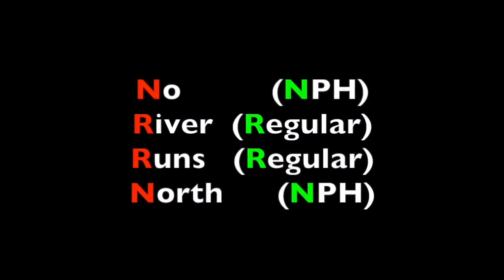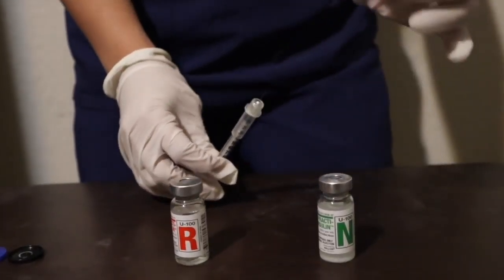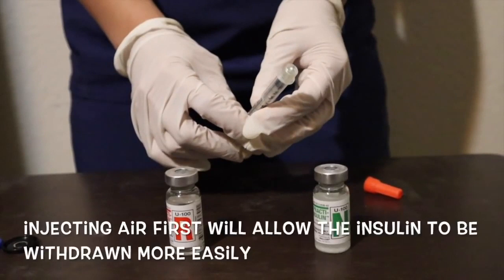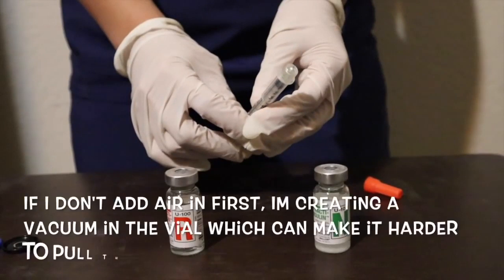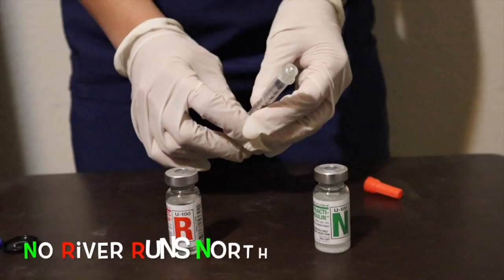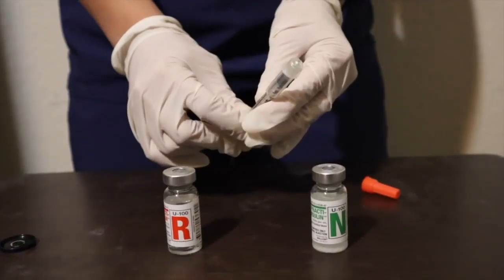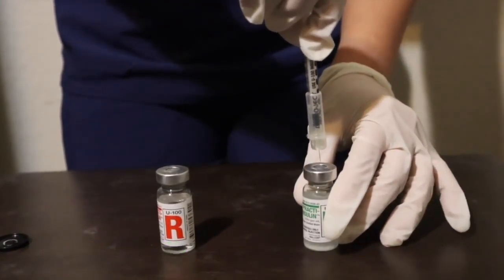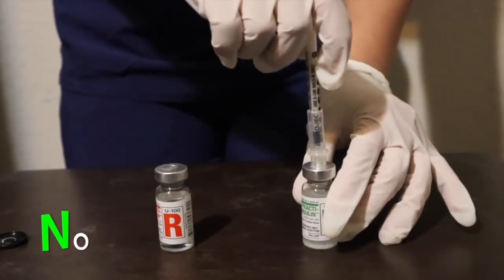Let's go ahead and draw up the insulin now. The mnemonic that I was taught and has stuck with me to this day is: no river runs north. I am removing the orange cap and will now inject air into the vial first. Injecting air will allow the medicine to be withdrawn more easily. If I don't add air in, I am creating a vacuum in the vial, which can make it really hard to pull the plunger out and get the insulin. So — no river runs north — draw up the same amount of air as my NPH order and inject that air into the NPH vial. That is the N in the 'no' part.